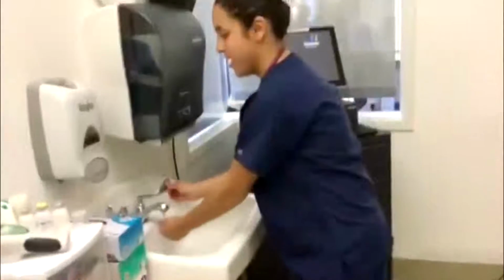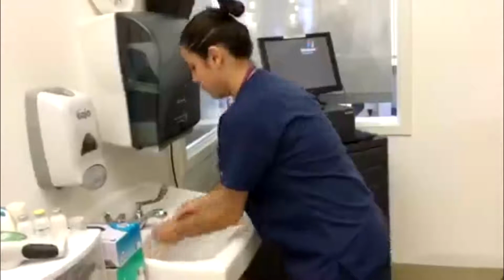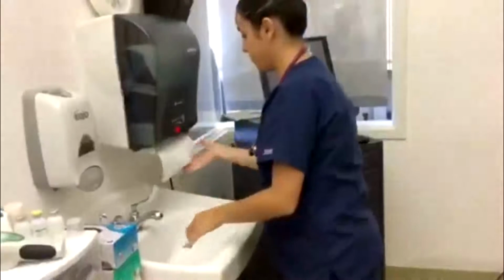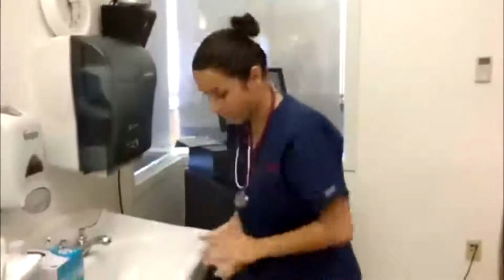Making sure that I wash my hands. And also making sure that I met all 6 rights, so that I had the right patient, the right drug, which is Zosyn, the right route, IV, right time, which is now, right dosage, 25 milliliters per hour, and right documentation, which I'm about to do now.